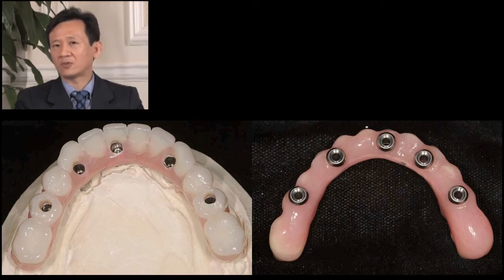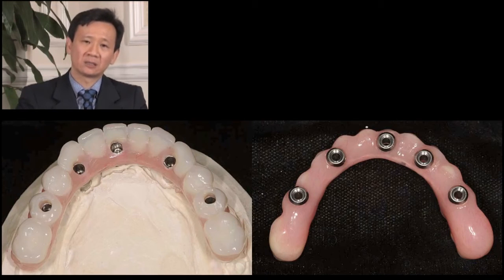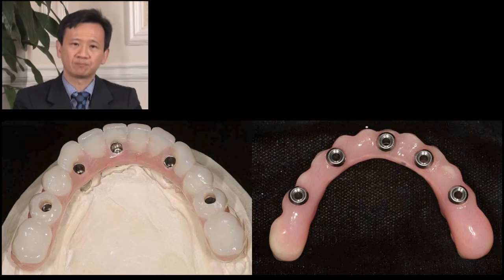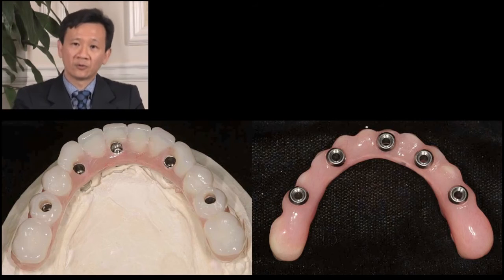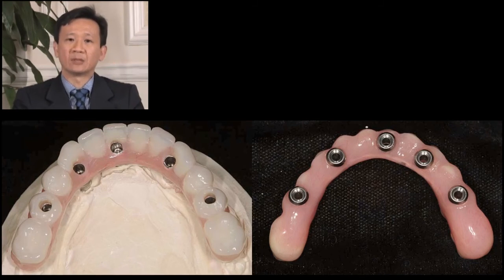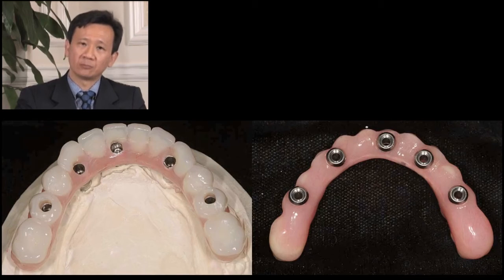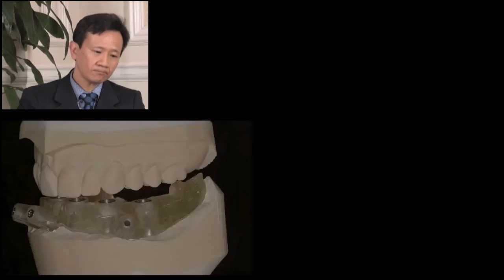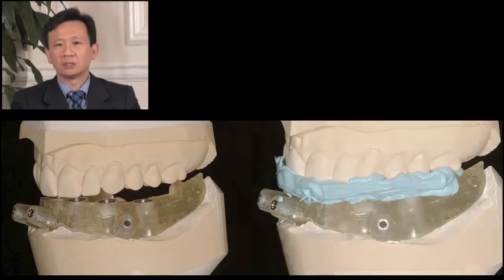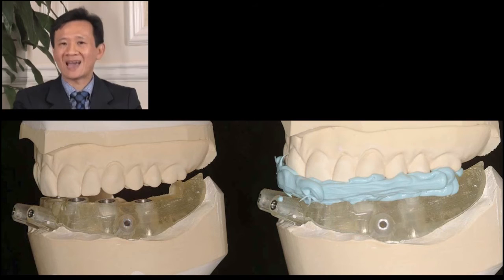So therefore, if the system is as accurate as we think it is, and if the implants are placed to the positions that we feel that it's being placed, if the implants are off by the 1.1 millimeters or the small degree, maybe the implant will move slightly as we torque the prosthesis to place. But the restoration is rigid and holding the position of the implants as it goes through the healing process. Once completed, the surgical template, we will fabricate an interocclusal index for the surgical procedure as the original protocol.